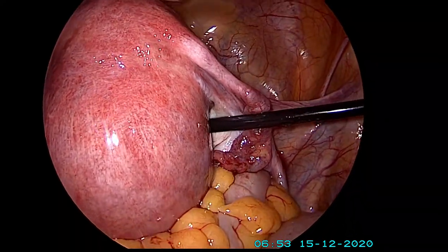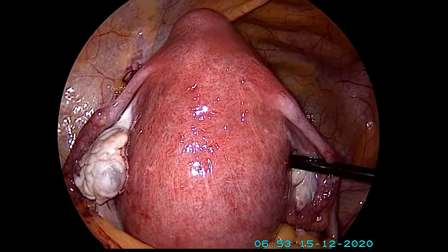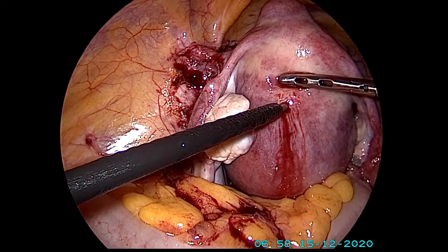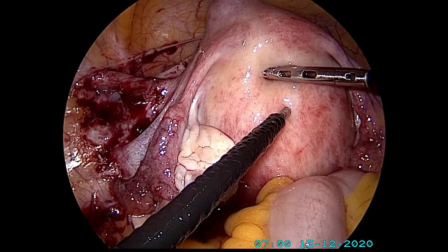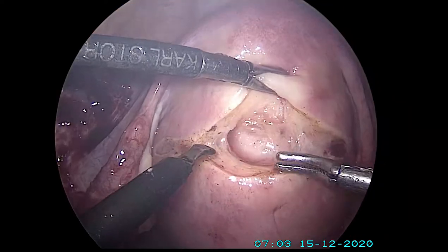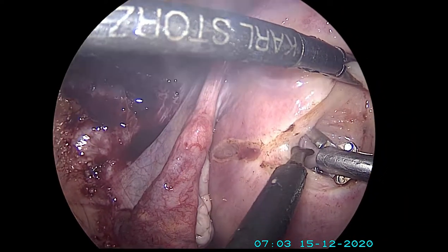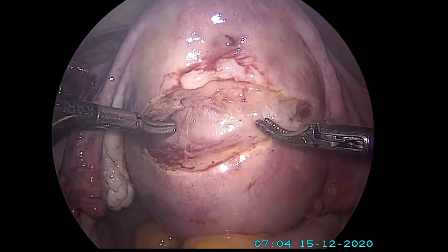What you see behind the uterus, what I'm lifting up, is a huge fibroid — almost about eight to nine centimeters. Here we are injecting a chemical into the fibroid, or rather the junction of the fibroid and the uterus. As you can see, it's making the uterus white; it reduces the blood supply, thus making the surgery more safe. We're now cutting the outer capsule of the fibroid.